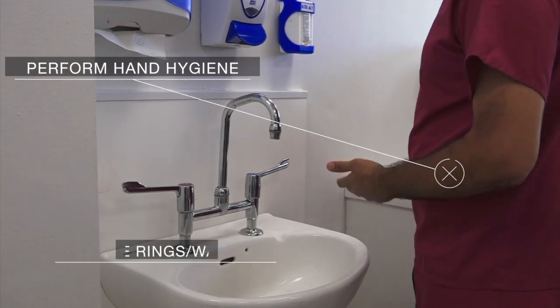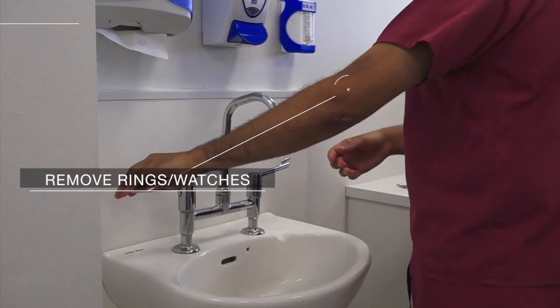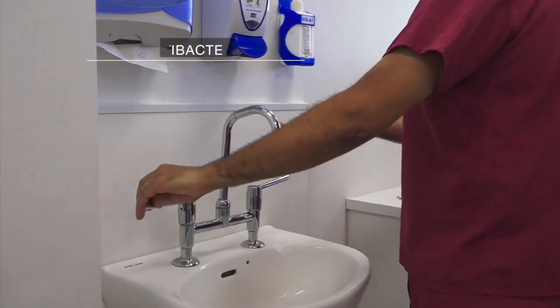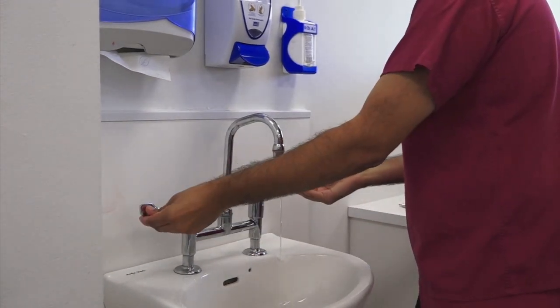Perform basic hand hygiene. First remove rings and watches. Apply antibacterial soap to a cupped hand. This can also be done with alcohol based hand rub.